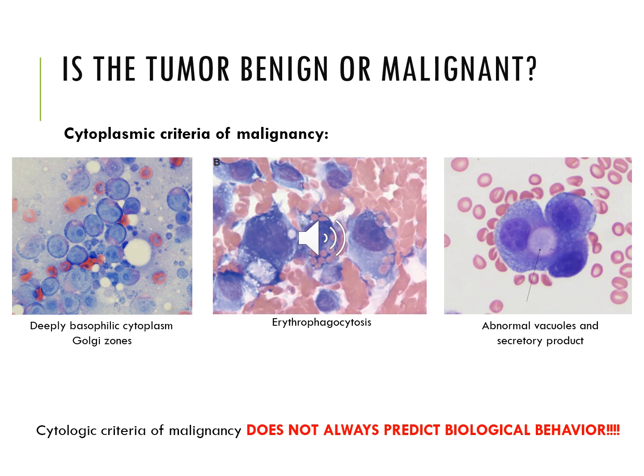Something else that we can see in the cytoplasm are what's called secretory products or secretory vacuoles. Some spindle cell tumors, such as osteosarcoma and chondrosarcoma, will produce matrix, which you can see in the cytoplasm or surrounding the cells. It's this kind of homogeneous eosinophilic material. And then what we see here is actually an example of transitional cell carcinoma, which is a type of epithelial neoplasia.